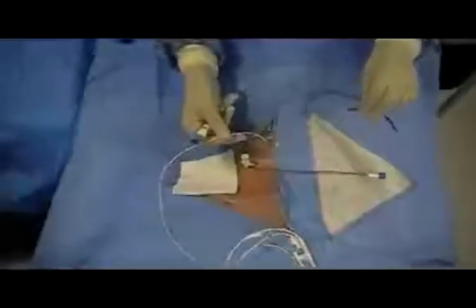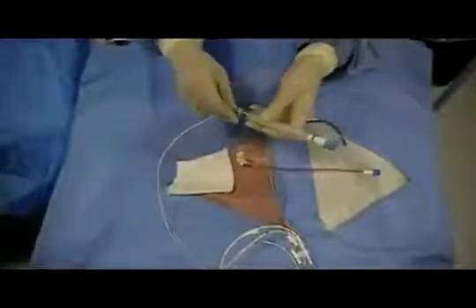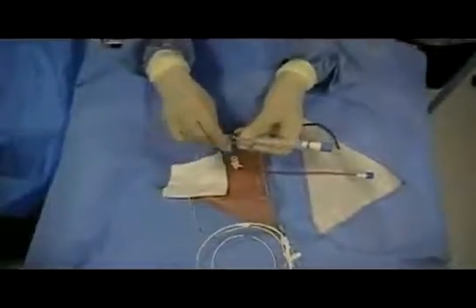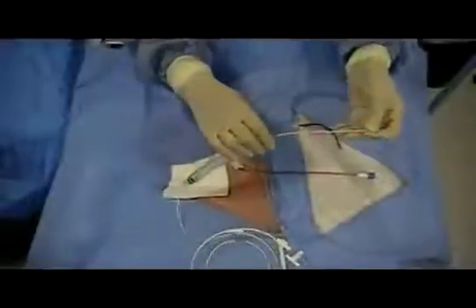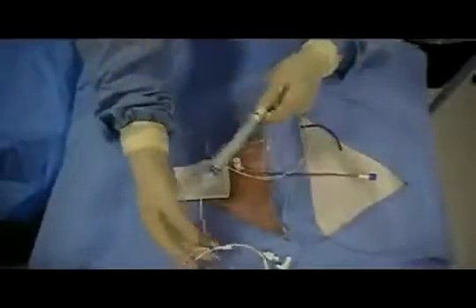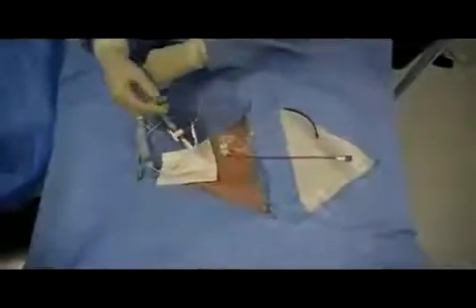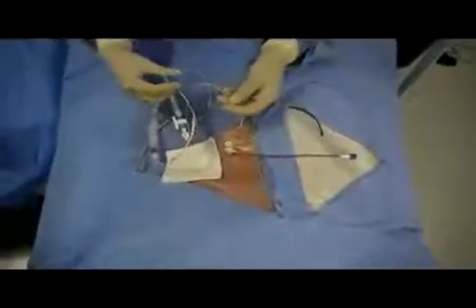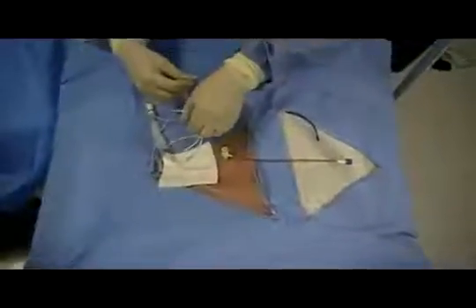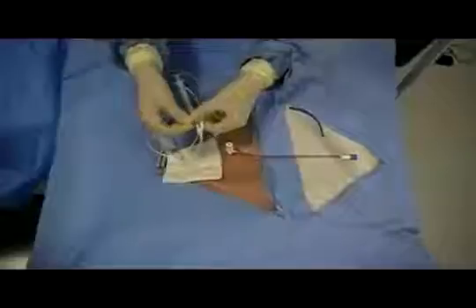Next, the contamination shield is placed. The contamination shield needs to be placed over the pacing wire prior to floating it into the patient, and can be placed out of the operator's way until the pacer is successfully placed. The contamination shield should be left compressed until capture is achieved. Next, the balloon is tested at the distal tip of the catheter to ensure that it inflates properly. Once proper functioning of the balloon is verified, it should then be deflated.